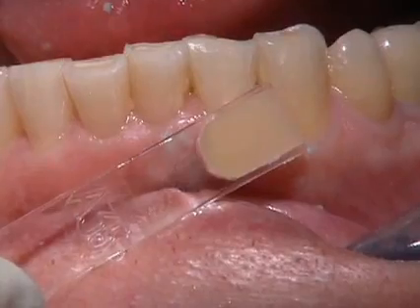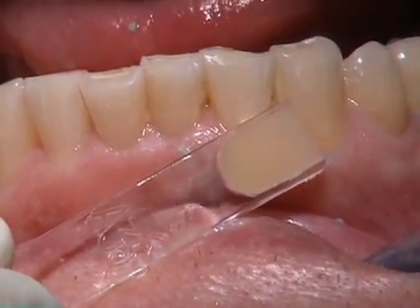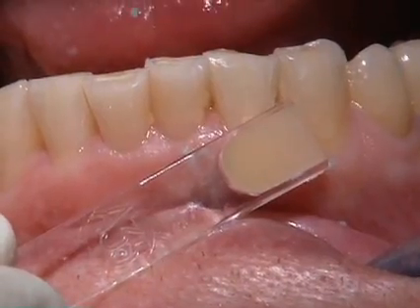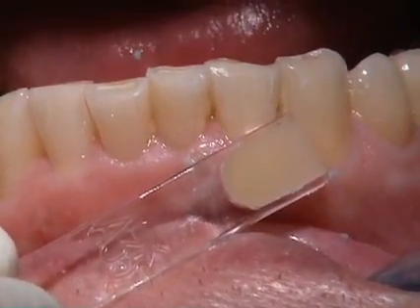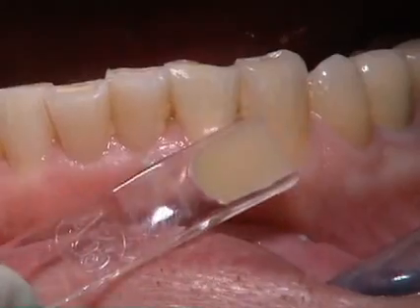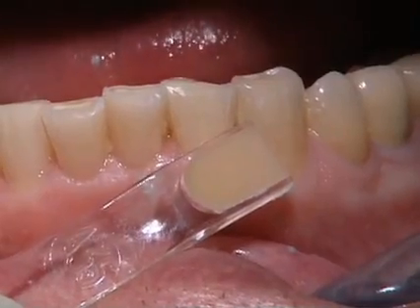If you look at the guide, there's a recipe that builds the shade. This shade is actually built with opaque A3.5 and enamel A3.5 — unlike what we just discussed, both shades end up being A3.5, but often you'll find a much darker dentin with a lighter enamel shade over it that gives the end result. With this shade, it happens to be both A3.5, but the difference is the dentin is much more opaque and the enamel is much more transparent. The end result is a darker, more opaque dentin showing through a lighter enamel color, which again gives us that chameleon effect.